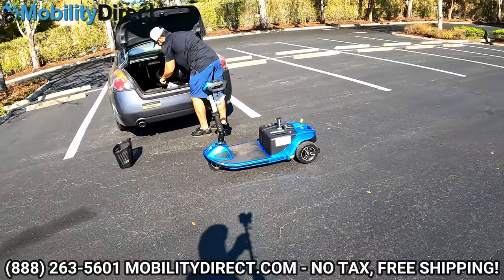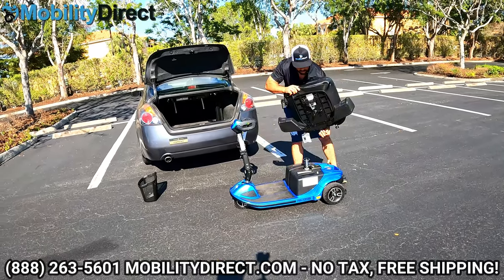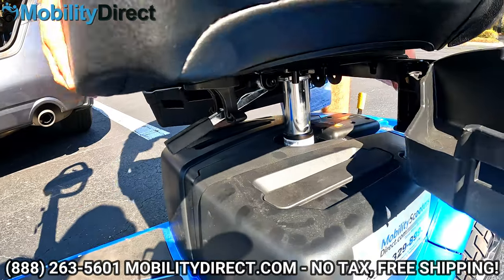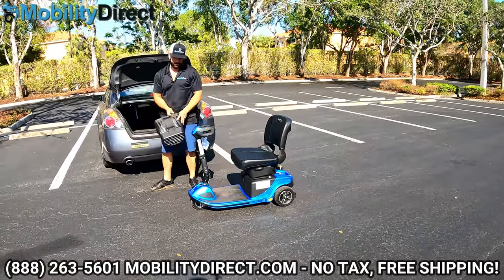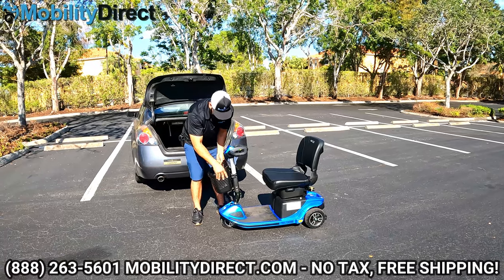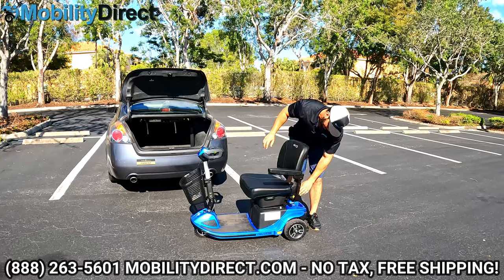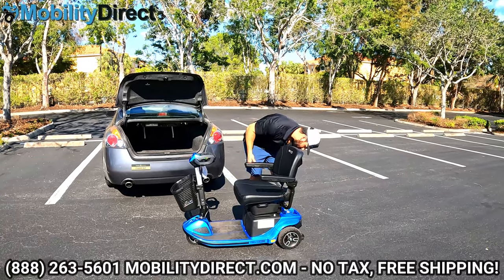Grab the seat — remember, the underseat storage containers need to be open. You can see there's a male connector underneath the seat that falls into the seat post female connection point. Line it up, level out the seat, and drop it in. Close the underseat storages and put the backrest back up. For the basket, there are two hooks on the front steering column and two rails on the back of the basket — just line them up and drop it in. Then put the armrests back in and we're done.